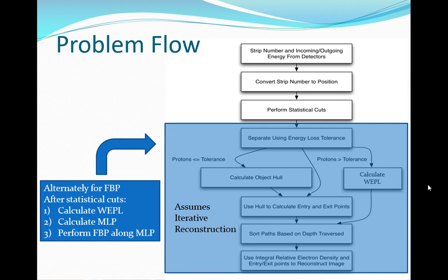Because in real life, things don't gain energy, right? So something's wrong. The bottom half of this varies by what technique you're using to do reconstruction. What's done over here assumes that we're doing iterative reconstruction. What we do is iterative reconstruction most of the time.